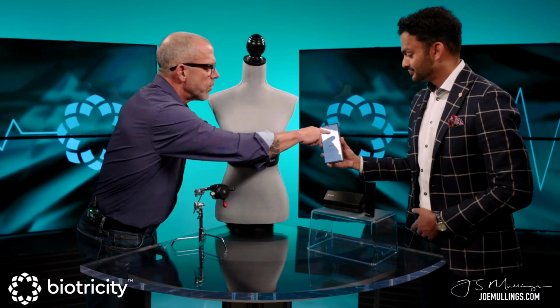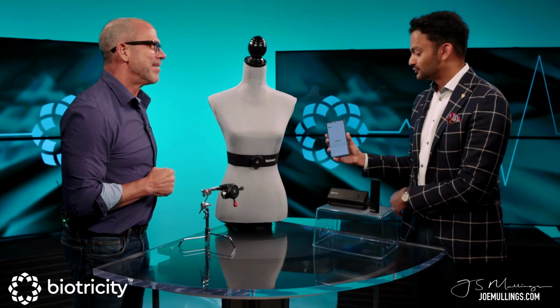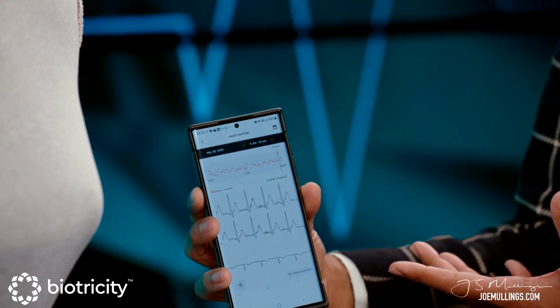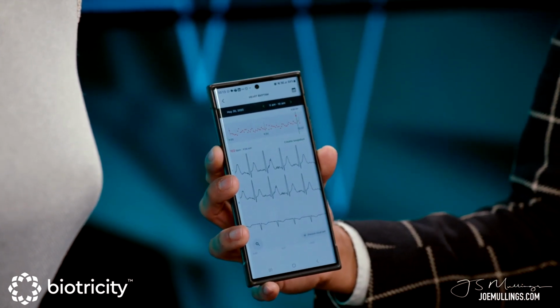I want to know what you were doing right there. Right, that's an outlier data point, exactly. So it's a 102. So maybe I was getting up, maybe I was, and I can go and look at exactly that outlier, and it will load instantly. And okay, so the ECG looks fine, but this is something that's an outlier, and I can analyze that.